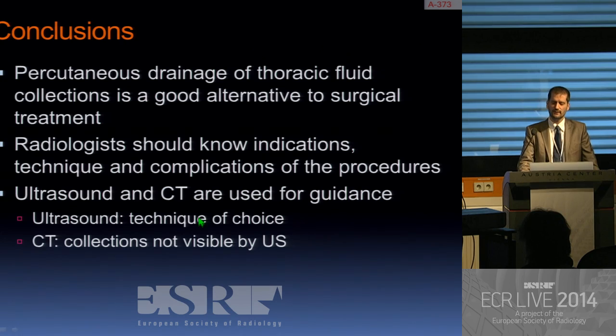In conclusion, percutaneous drainage of thoracic fluid collections is a good alternative to surgical treatment. Radiologists should know indications, technique, and complications of the procedures. Ultrasound and CT can be used for guidance, but in my opinion, ultrasound should be the technique of choice, and CT may be reserved for collections that are not visible with ultrasound.